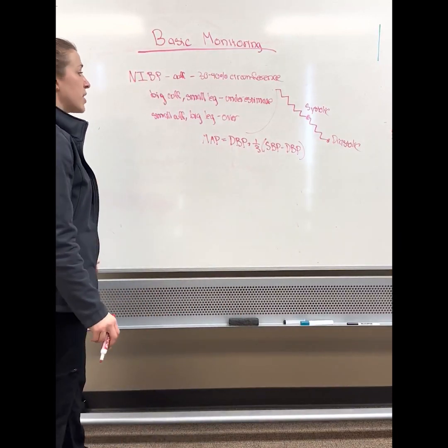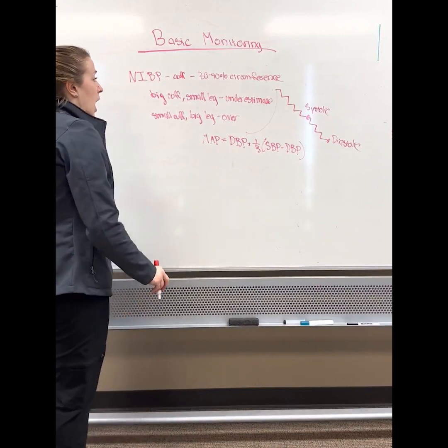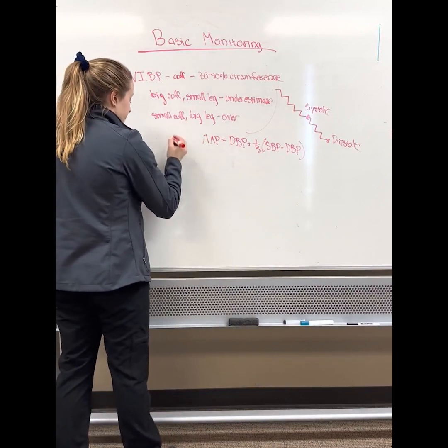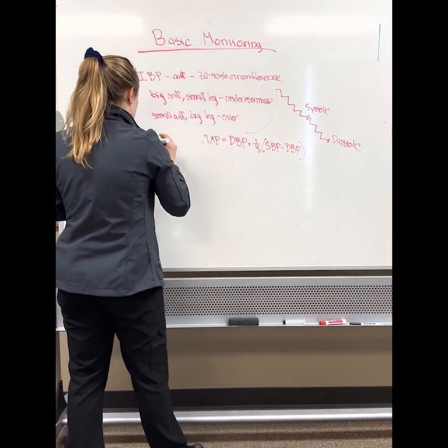So then from there, you get 3 numbers on your screen. Systolic, diastolic, mean. I like the systolic blood pressure. I also like markers that work, but I think this one is gonna work.